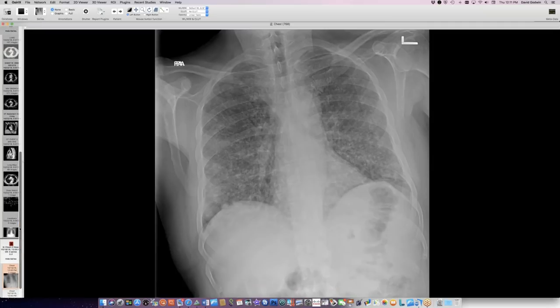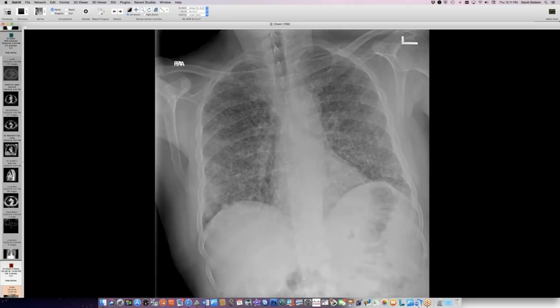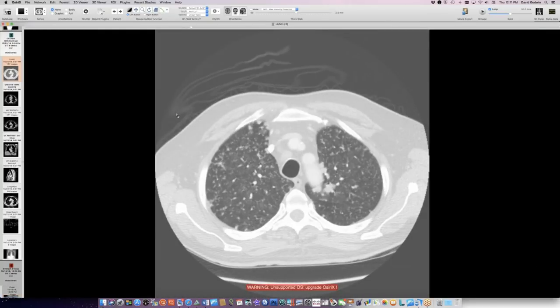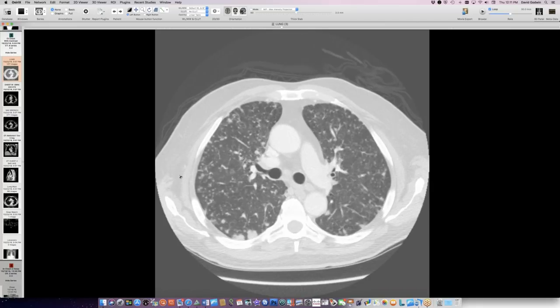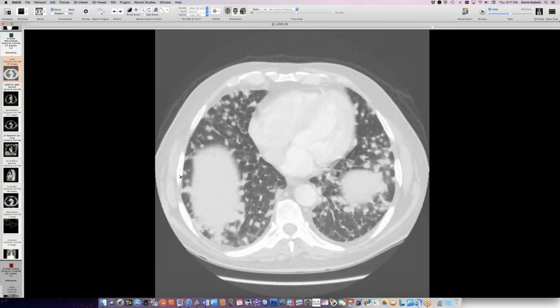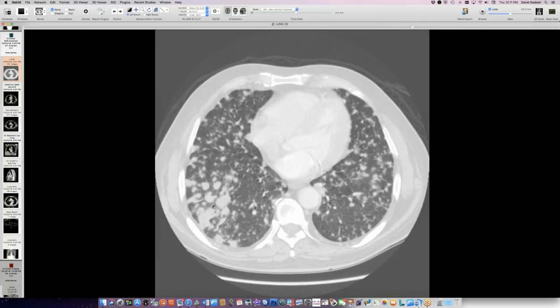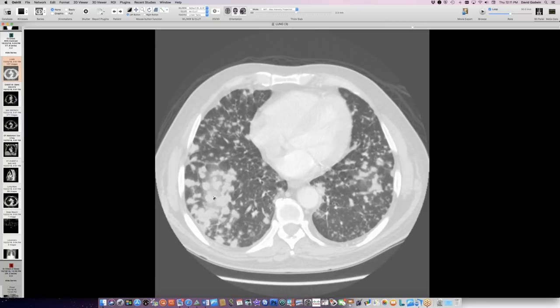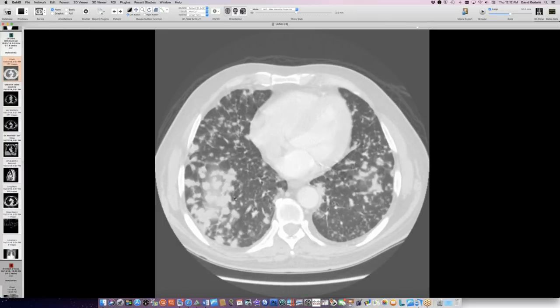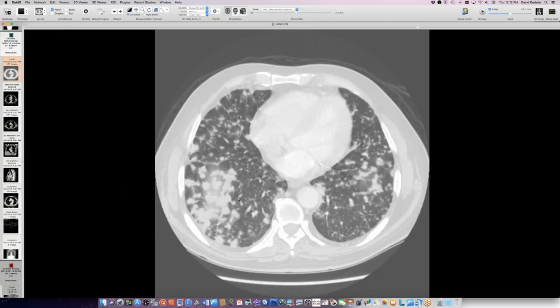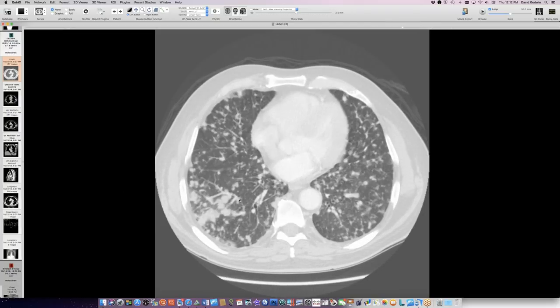With this fine nodular pattern, everybody's concerned about TB — that was my first consideration. He's got a bunch of lung nodules, random throughout the lungs. Some are very peripheral along the edges, implying they might be bloodborne. Down in the bases there are much larger nodules. The lung just doesn't look that bothered around these big nodules — if this were TB, we should have more sogginess, more inflammation around the nodules. They looked at sputum and lavage and nothing grew for a period of time. So what do you think this turns out to be?